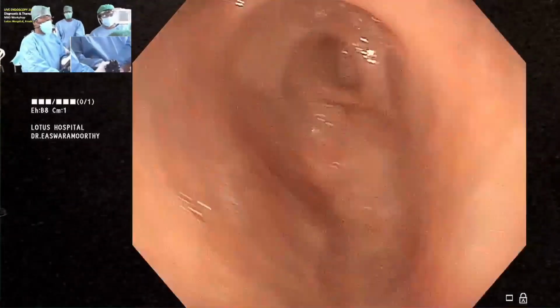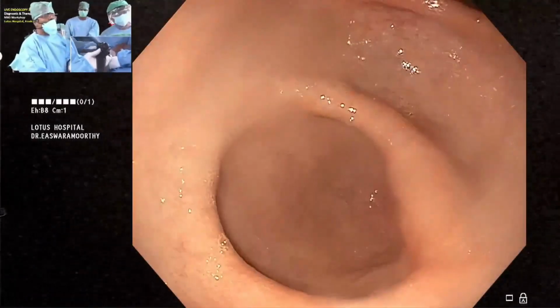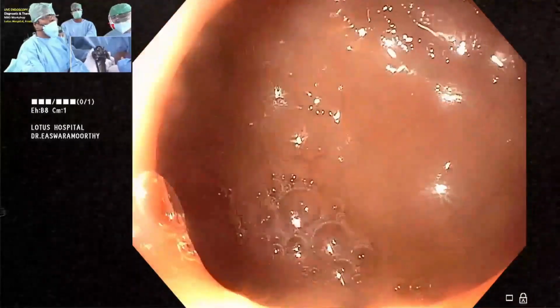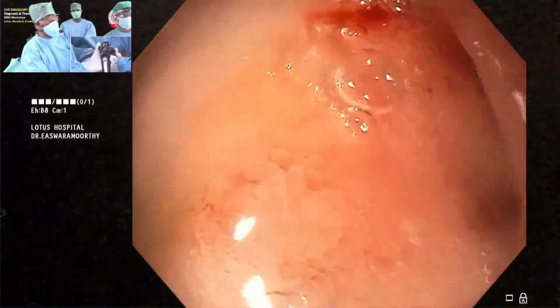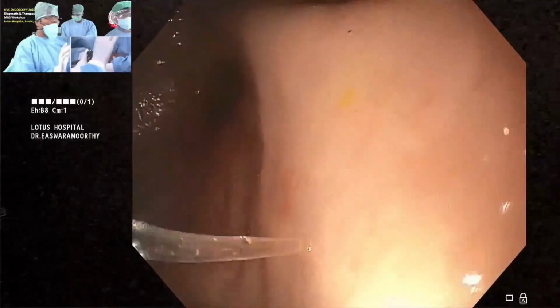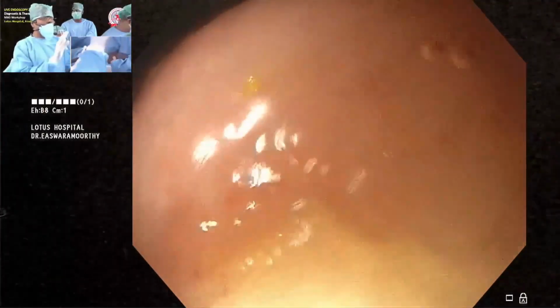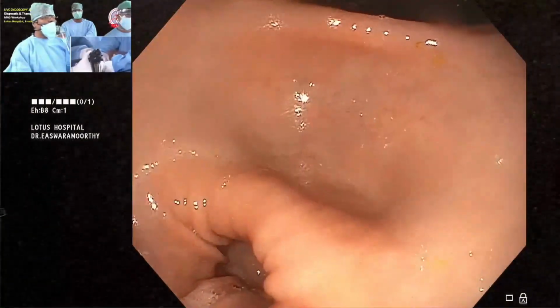Okay, now you fall back. What you see here is actually a deformed duodenum. That's all I can tell you. But it is not stenosed anymore, and it is taking an acute right turn like this. But there is nothing like, this is the exact place where she had a stenosis. Now it is easy to go in. Your scope diameter is 9.2. I am sure a 10 to 12 millimeter diameter is good enough for her to have a near normal diet.